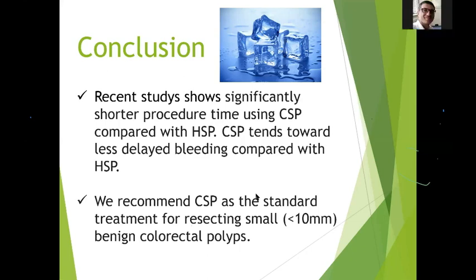They think detection may be replaced by artificial intelligence, because when I am sleepy, or when I have drunk too much the night before, it is maybe difficult to perform colonoscopy, and sometimes there is a possibility to overlook a flat type lesion. But artificial intelligence is always there, so it can detect the lesion even if I am drunk. Anyway, detection may be AI-assisted completely in the future. But I think for diagnosis, human is still better. Dr. Misawa and Dr. Mori also think so.